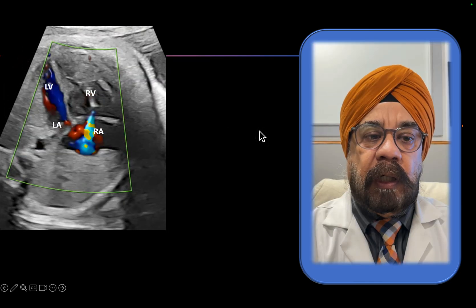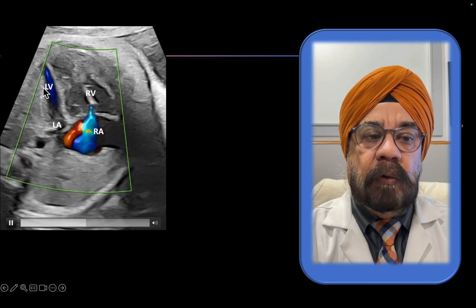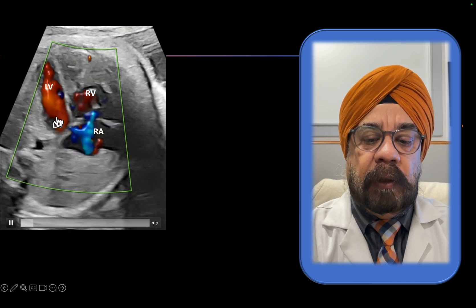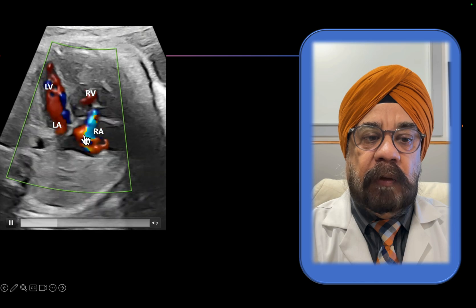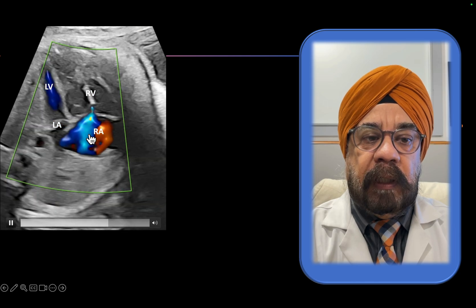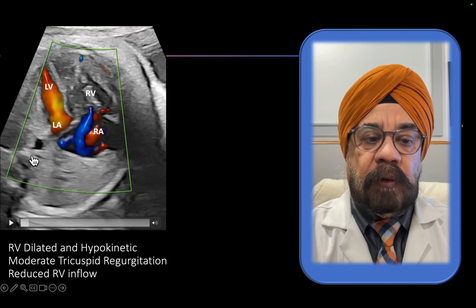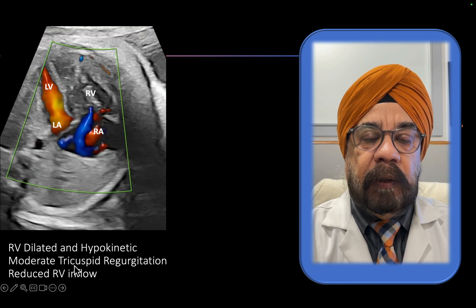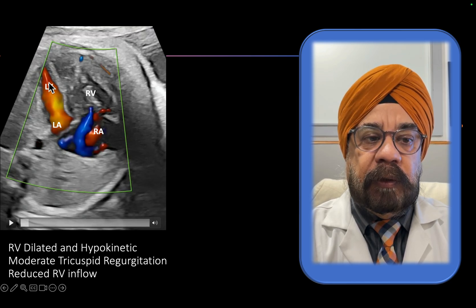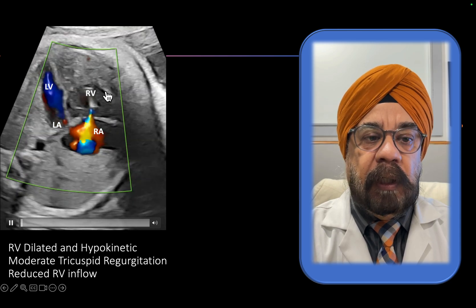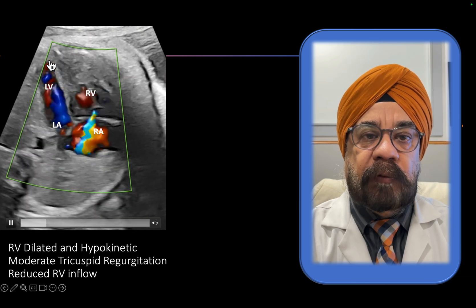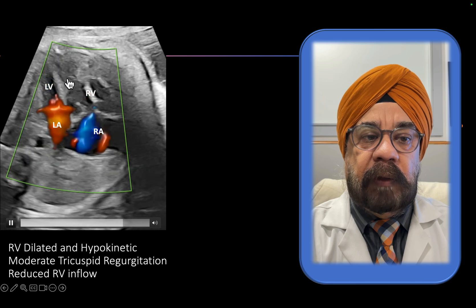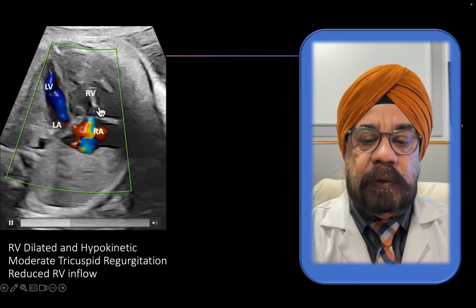On color Doppler you can notice that the LV inflow is good. The RV inflow is reduced and there is significant moderate-to-severe tricuspid regurgitation. The RV inflow is markedly reduced compared to the LV — you can see the LV apex filling right up to the tip, but the RV is not filling. It's essentially only LV inflow of this nature.